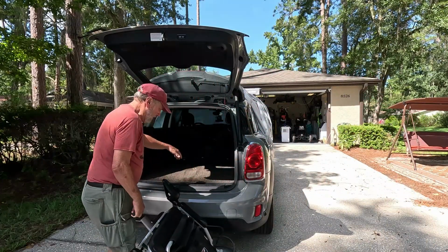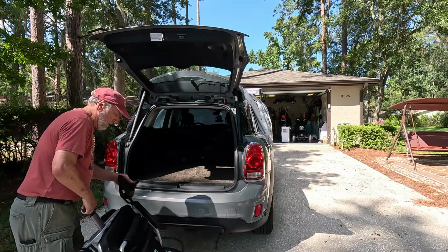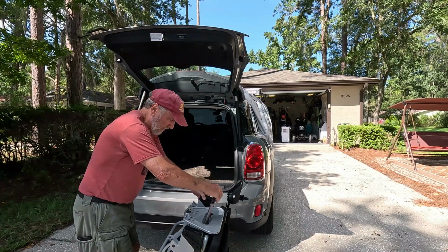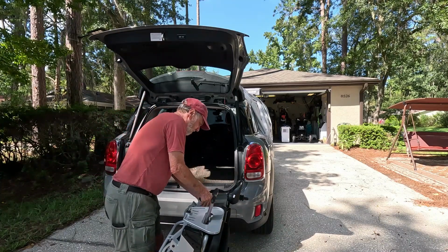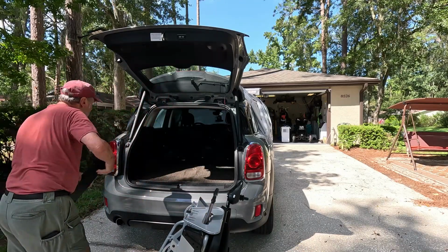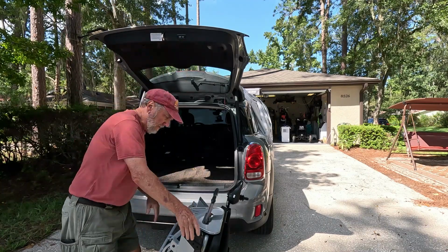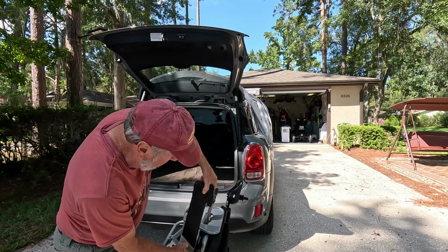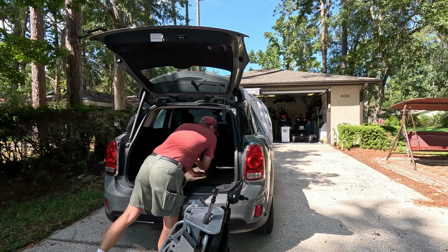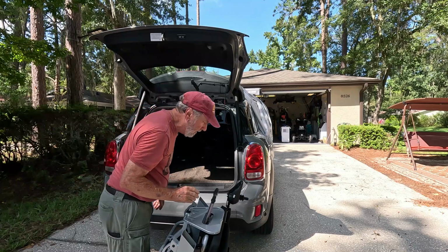And I'm going to put it in that way, but here's what I need to do, is I need to take the batteries out so that that'll give me a little less weight that I have to pick up. So I just pull this out, and I'll put that in there like that. And then this one, I'll put him over here. And there's not anything else that I can really take off.